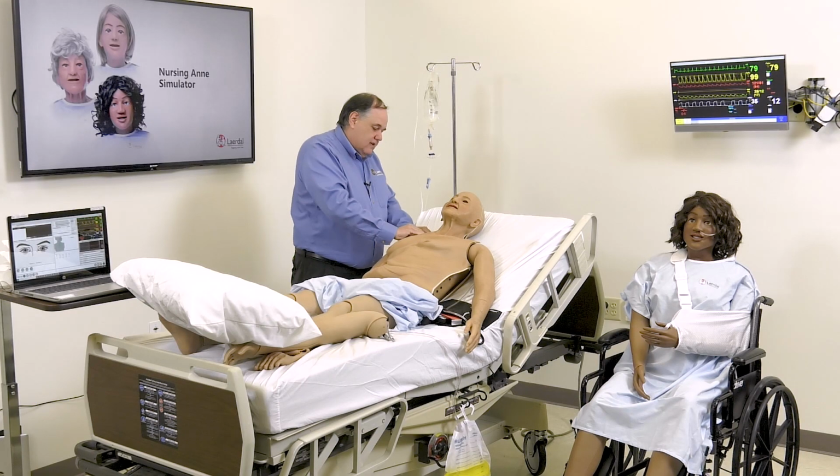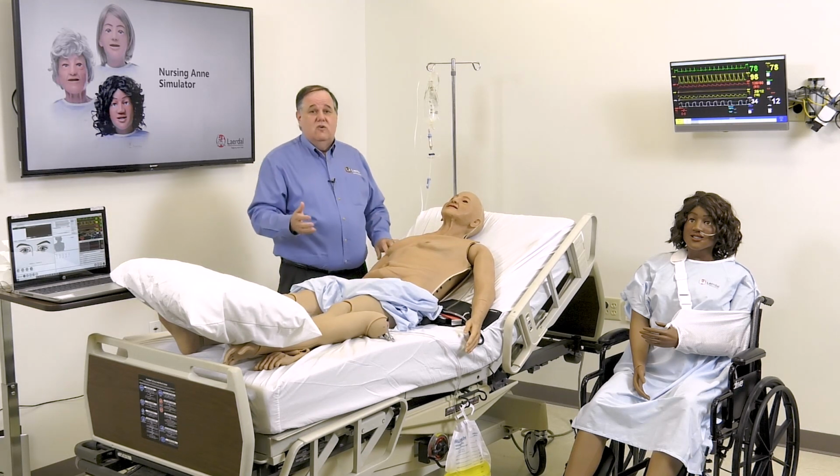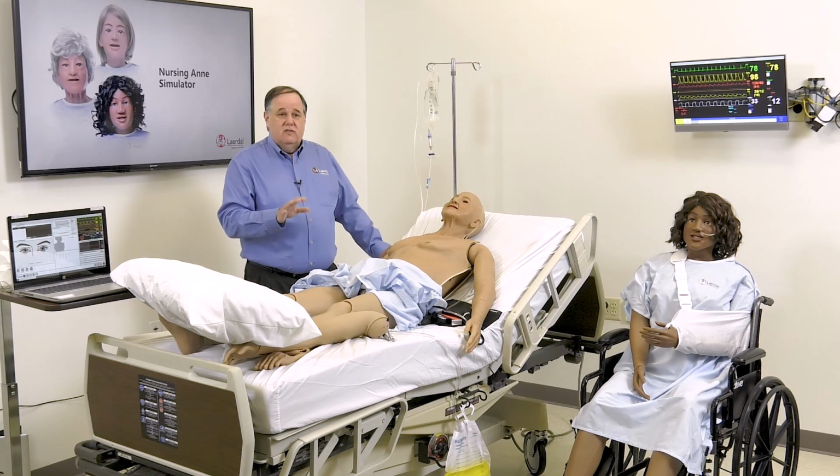Ed, while you're reattaching the skin, there was a question about cleaning the skin, just dealing with COVID, cleansing between students. Is there any recommendations for that? Yeah, so given the current time, that's a great question. So I think it's good to pause from the skin and maybe talk about that for a moment. So absolutely, soap and water is your first agent to clean, and then to sterilize, we suggest you follow the CDC guidelines, and most alcohol-based cleaners that are recommended by the CDC are safe for use on the actual skin itself. Okay, but that's a very good question.